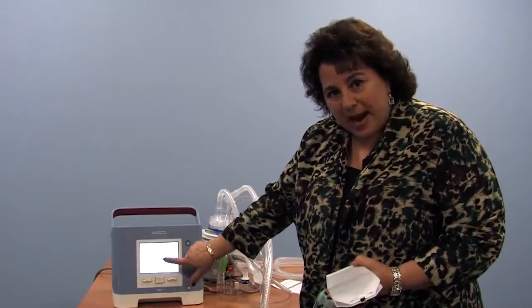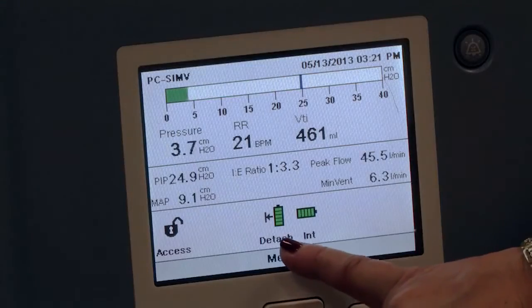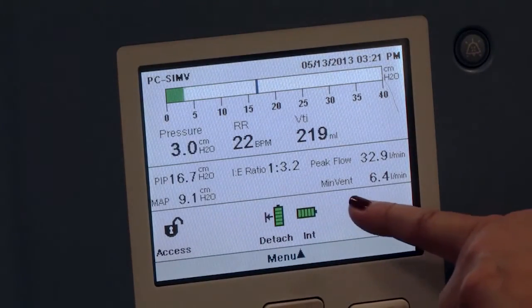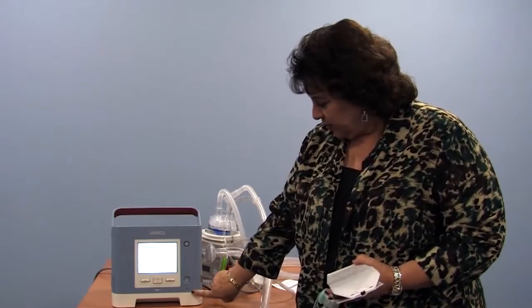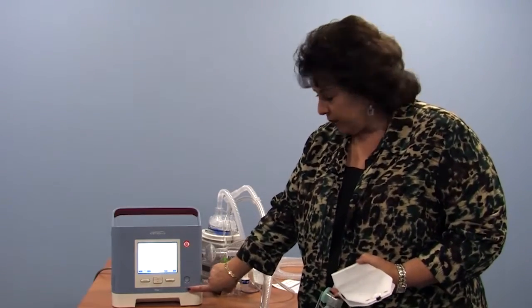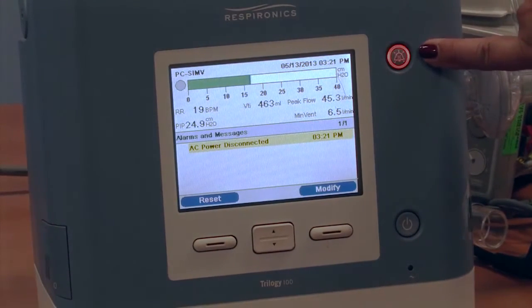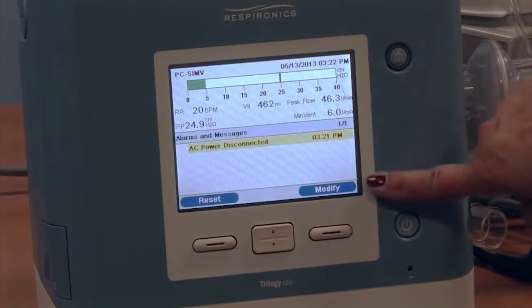So with regard to power, we saw the battery in the back. That's represented by the detachable battery here and the internal batteries here. Both are full and green, as you see right now. If I remove the power from the wall, a couple of things will happen. You see the green light that we pointed out in the beginning is now out. So we know right now that we don't have external power. We also see the yellow low priority alarm lit, and we see yellow in the alarm window.